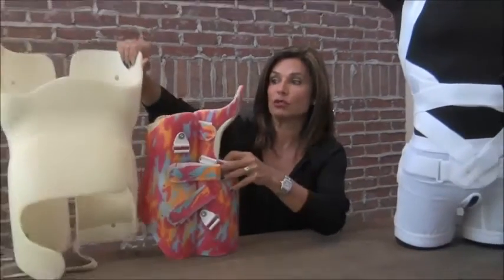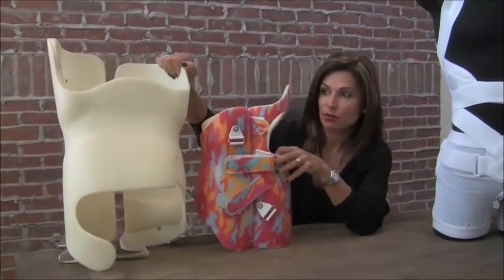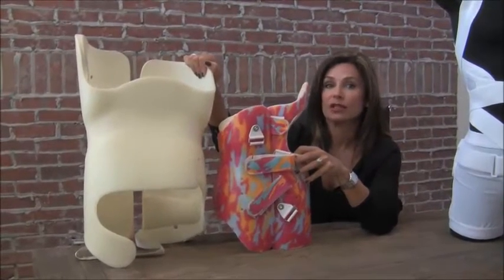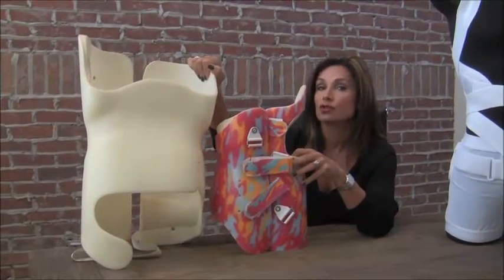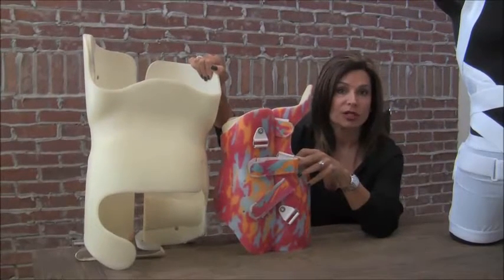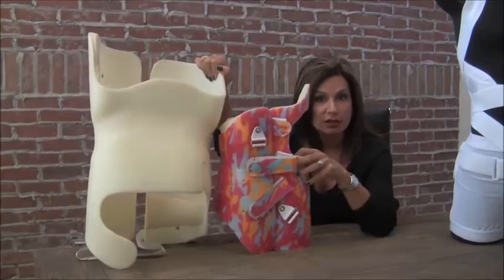Some of you may already even be wearing a brace and not really enjoying it, not being able to do the things that you love. The typical brace that's recommended is a rigid brace, which as you can see is quite bulky and quite uncomfortable. For that reason, compliance is really low. Also, these braces do not allow you to participate in sports or recreational activities.